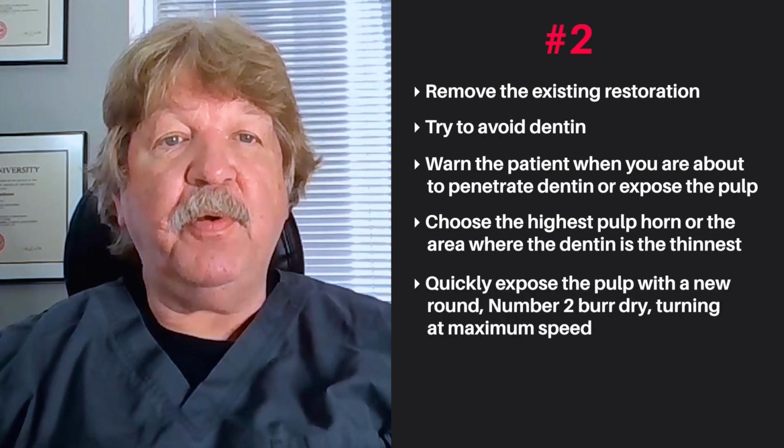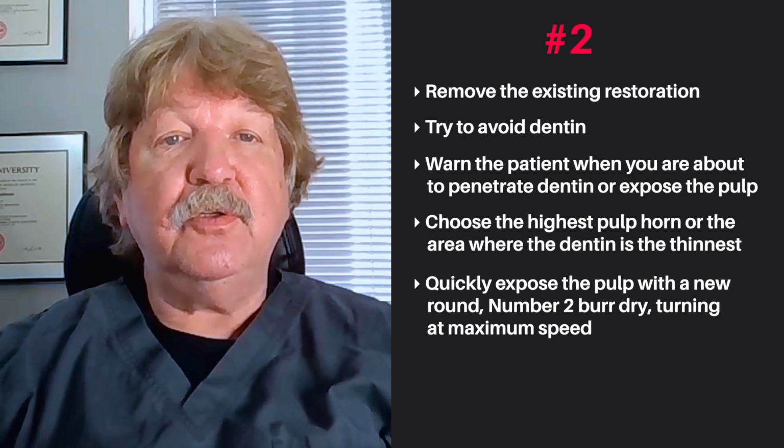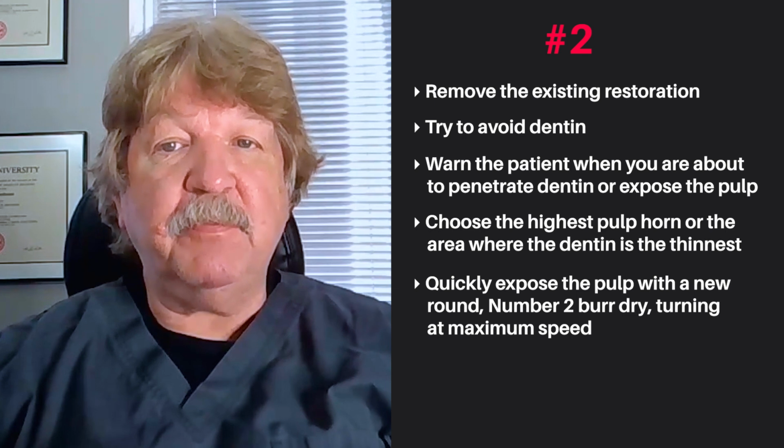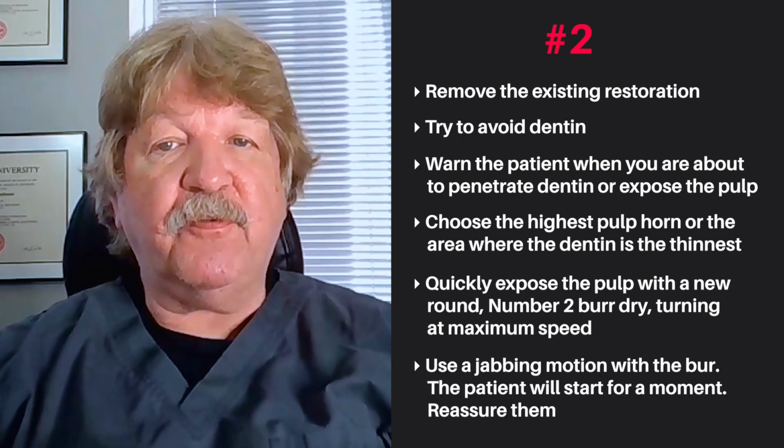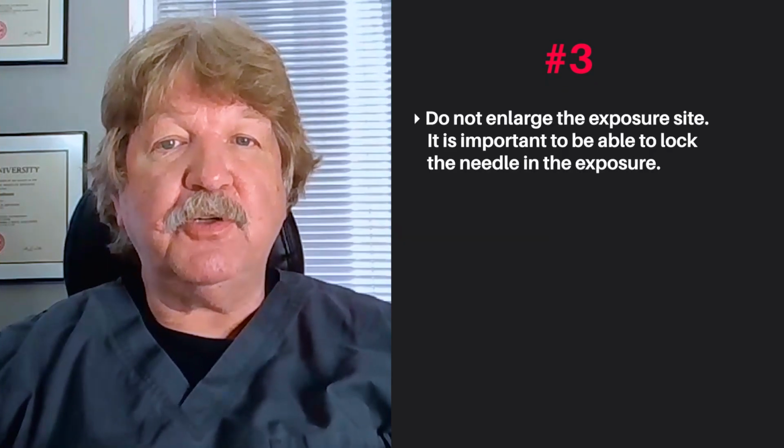Quickly expose the pulp with a new round number 2 burr, dry, turning at maximum speed. Use a jabbing motion with the burr. The patient will start for a moment. Reassure them. Thirdly, do not enlarge the exposure site.